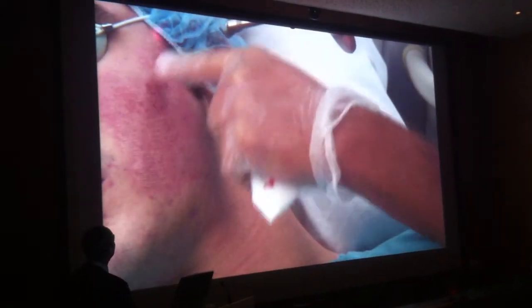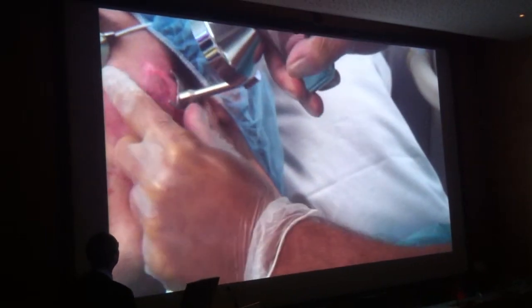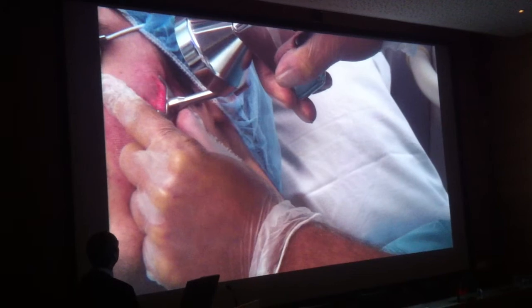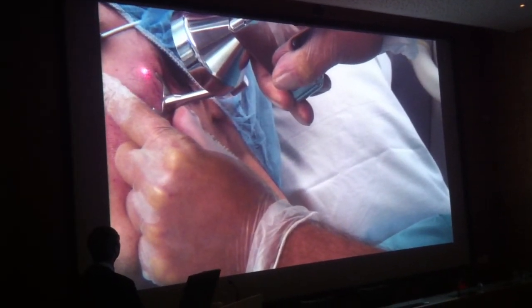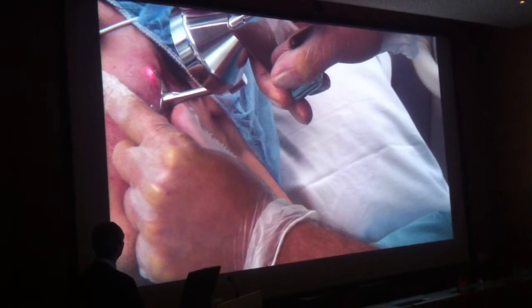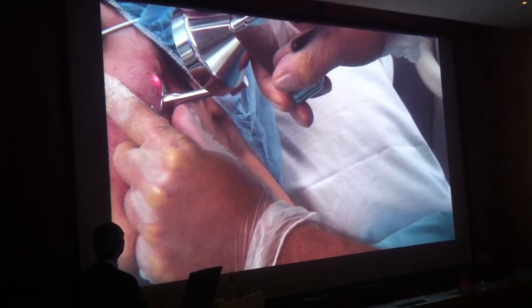Now, what I'm going to do is a second passage here where the biggest scars are, and I measured the distance between these two lesions before the treatment, and that was exactly 2 centimeters. I'm going to show you the kind of contraction that you can immediately get.